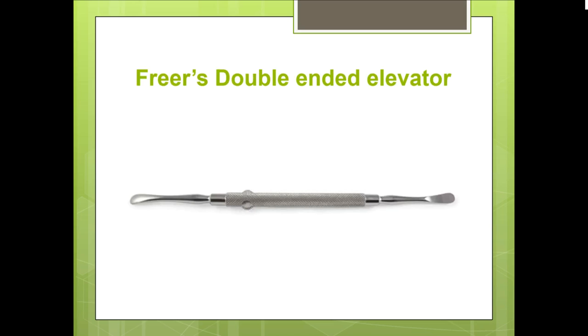This is the double-ended elevator, Freer's double-ended elevator. We will use this during the elevation of the mucosa over the nasal septum.